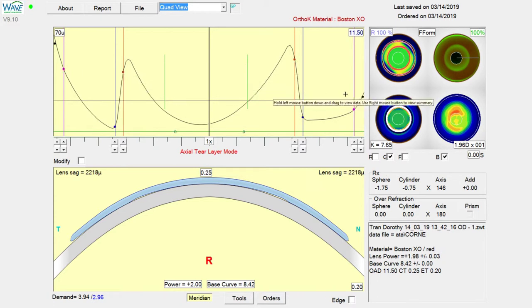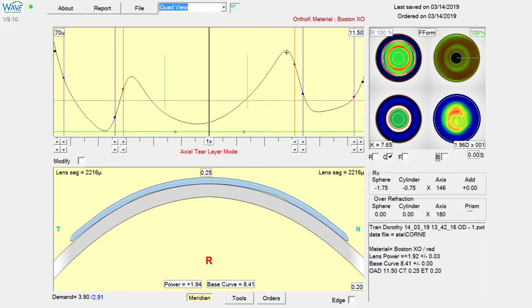The other thing we're going to do is turn the blending back on, so we're going to uncheck the box and you'll see the curve smooth out a little bit more.